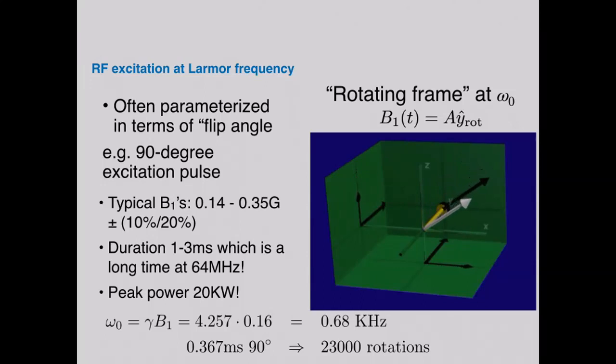In a very similar way, if I just apply a B0 field and perturb, then it would precess around B0, right? But because we're looking at the rotating frame, any rotation around B0 is canceled because we're rotating with it. So whatever is left, the only field that is effectively left, is the B1 field, and we're just rotating around the B1 field. So it's like the white line is rotating around the B1 field. Yes, the magnetization will rotate around this. Absolutely. And that's what's happening.